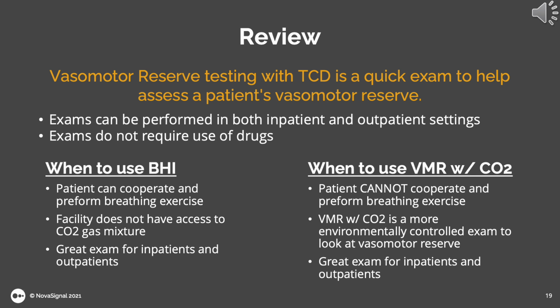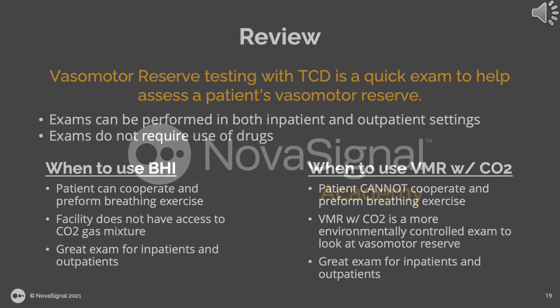So when should we use BHI testing? When the patient can cooperate with the breathing exercise, or when the facility does not have CO2 gas mixture available. When should you use VMR with CO2 testing? Mostly when the patient cannot cooperate with the breathing exercise. VMR with CO2 is a more environmentally controlled exam to look at vasomotor reserve with TCD. Again, both exams are great to use on inpatients and outpatients.